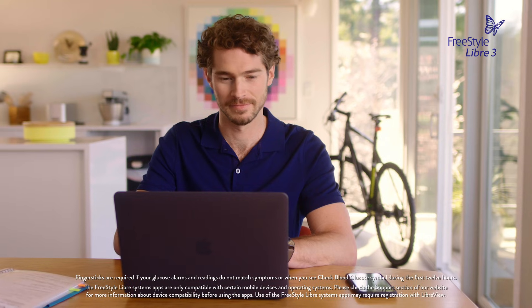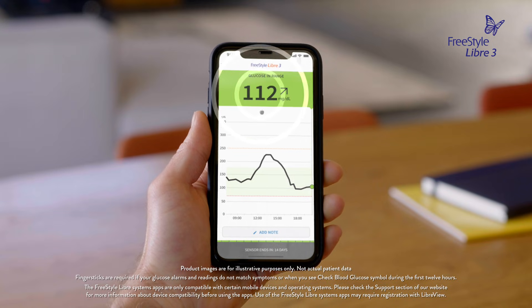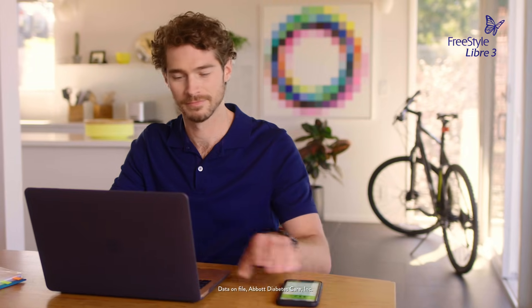Knowing my glucose is now as easy as glancing at my phone, because the sensor sends glucose readings every minute directly to my smartphone. So I can act faster to avoid a low glucose. The Freestyle Libre system is designed to fit into my life.